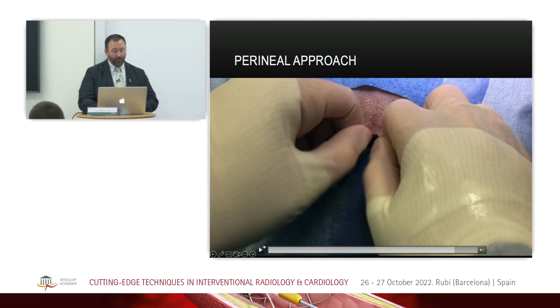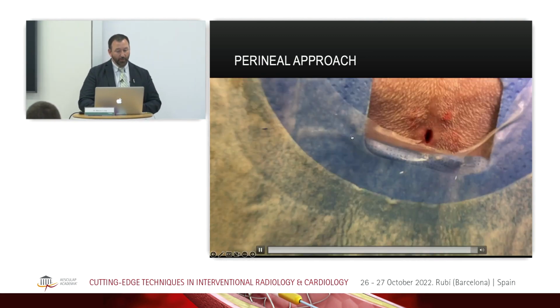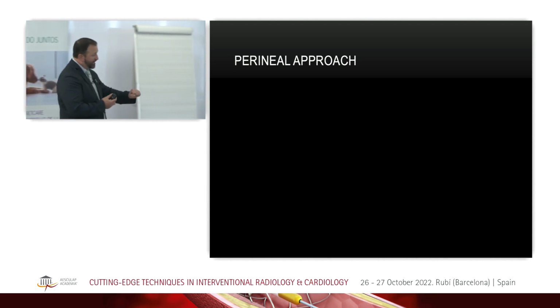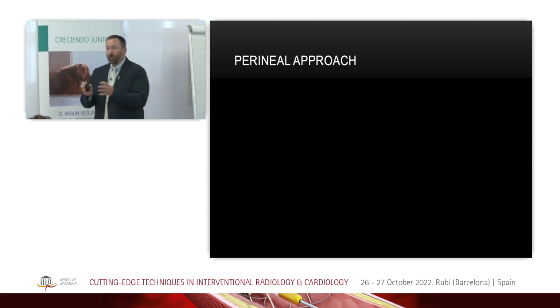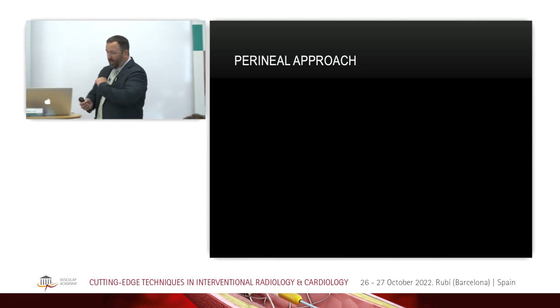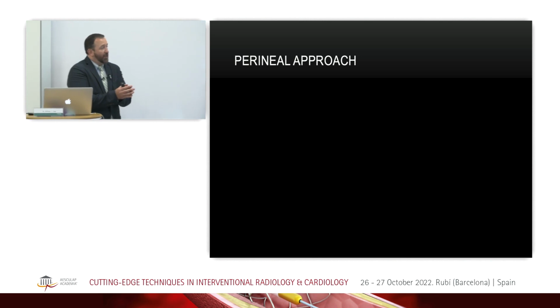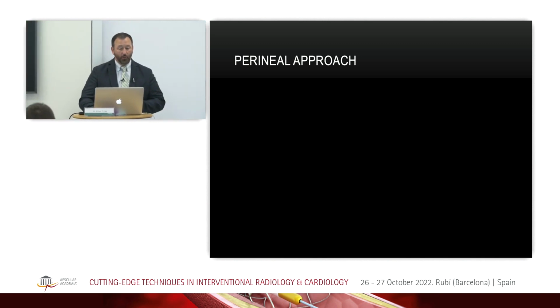And then the peel-away sheath, when you're done with it, you just pull it out, peel it, and then that's what you're left with. And we don't close it. We don't do any kind of suturing or anything, because essentially, since you've serially dilated, you've used dilators over the guide wire, you've only spread the tissue apart. So you haven't actually incised the tissue or created a new incision into it. You've just done a stick and you've serially dilated, so you're spreading the tissue apart, so afterwards it tends to contract down. And it's very rare that we actually get leakage afterwards.